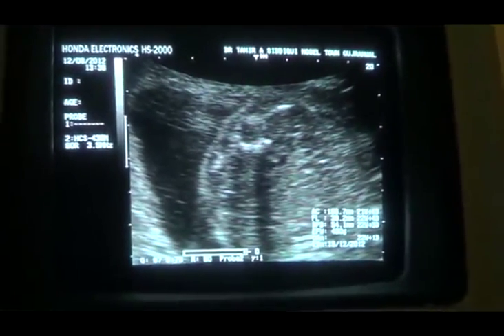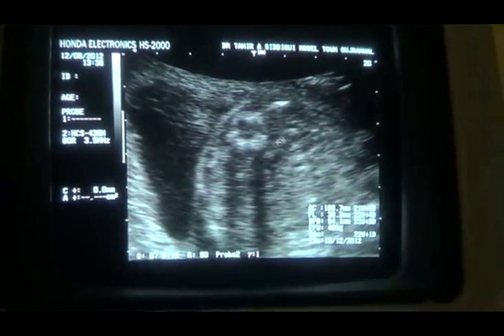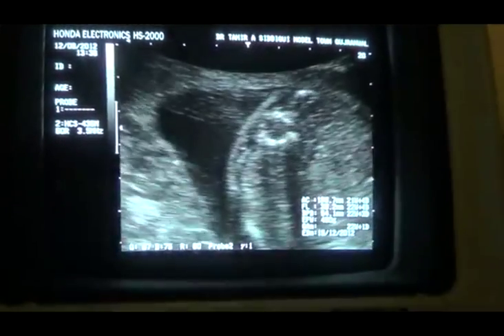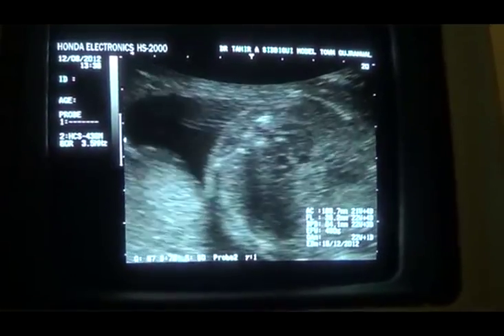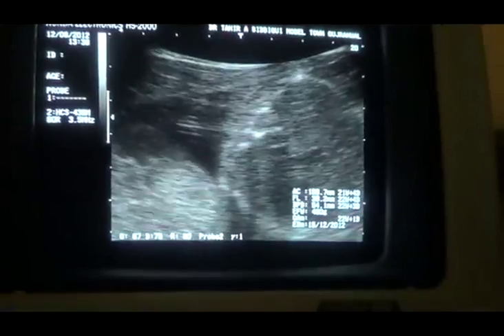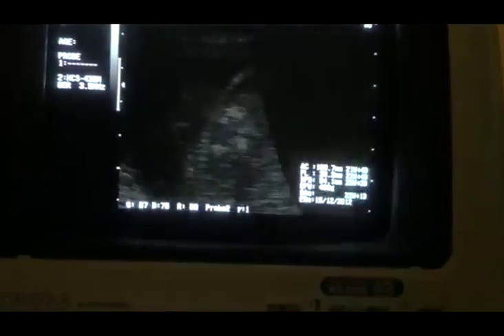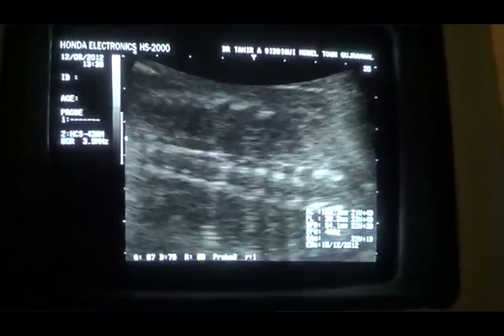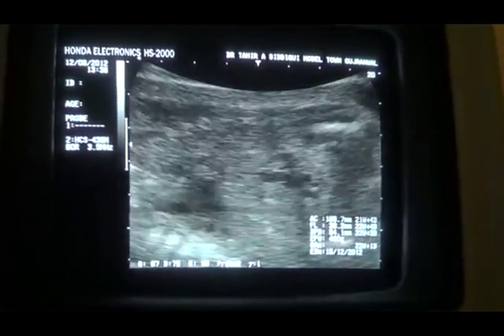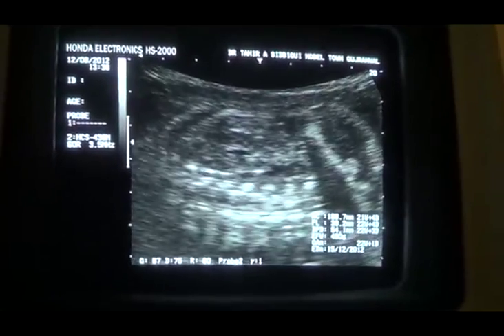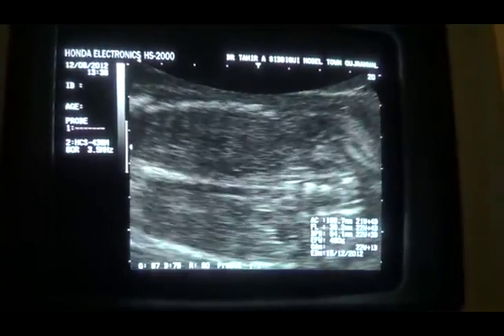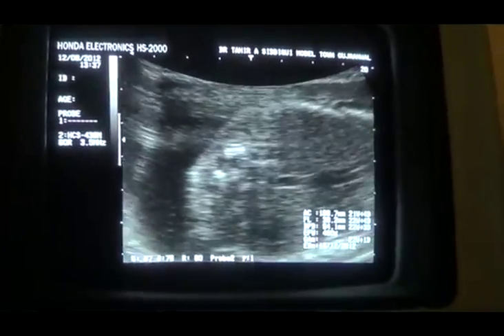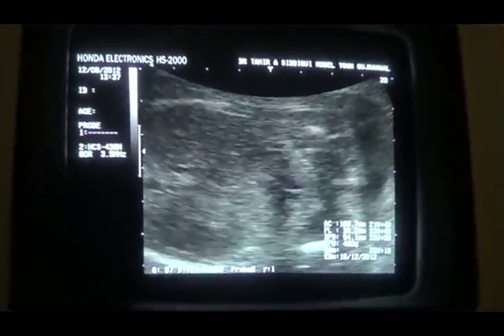Now these are the kidneys — this is a magnification so they will appear bigger to you. This is one kidney. The kidney was normal. The kidney and urinary bladder are normal. In the transverse section of the abdomen, the anterior wall is intact.